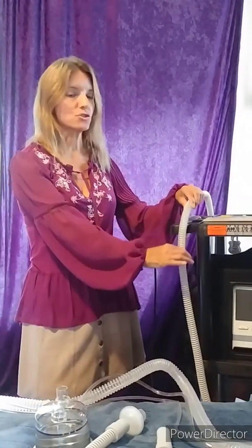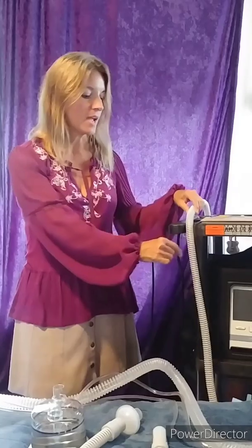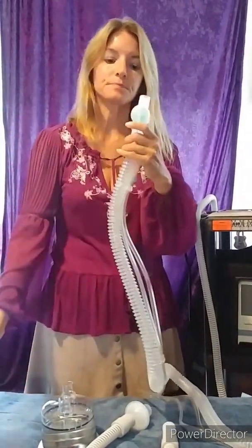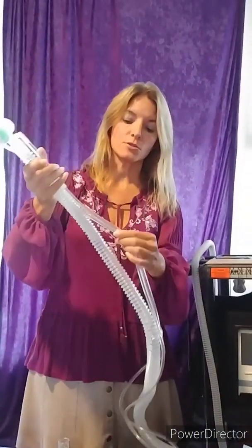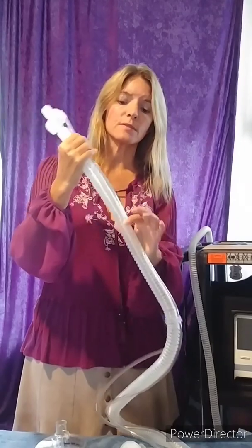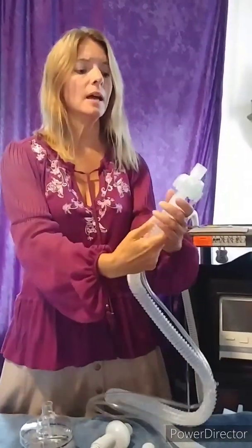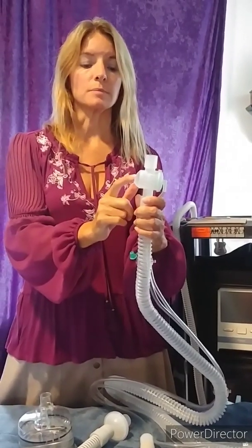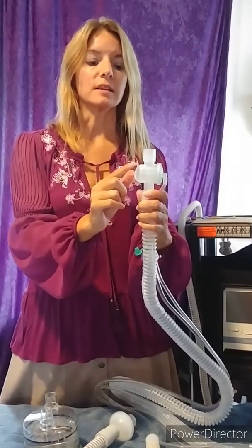Most people, when they find that they need ventilation to help support their breathing due to weak breathing muscles, are put on a ventilator and given the passive circuit. The passive circuit looks just like this — it's just a single tube. The active circuit looks different; it has two additional tubes along with the circuit, and an exhalation valve built right into the circuit, which is the primary difference between the passive and the active circuit.